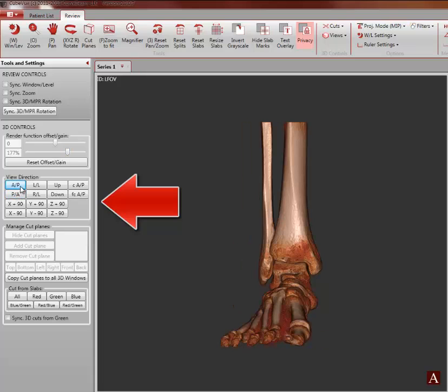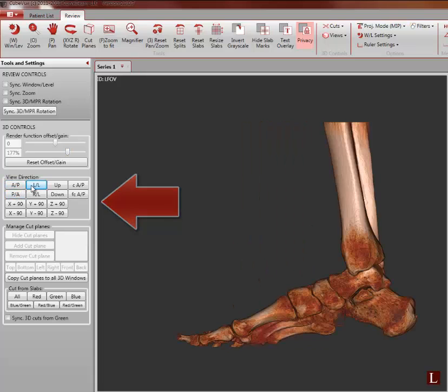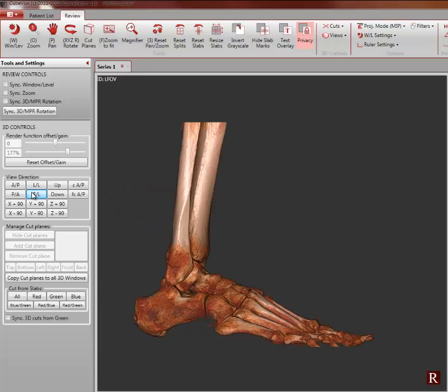The view direction tool gives you snap-to controls for quick rotation of the rendering to a desired orientation.